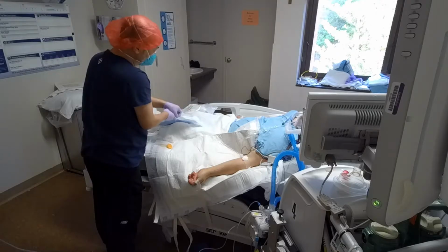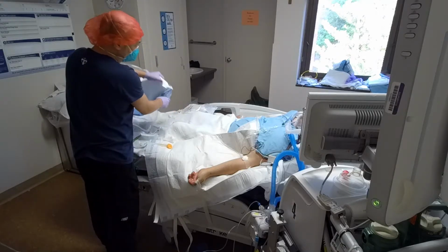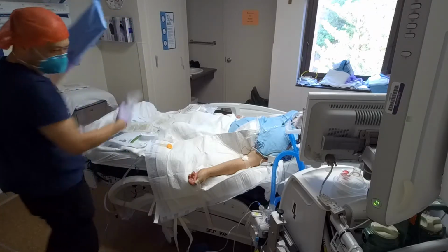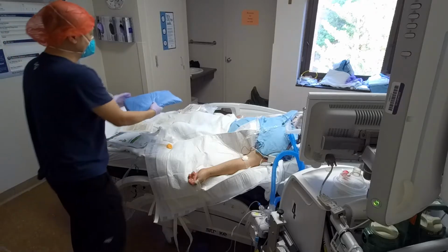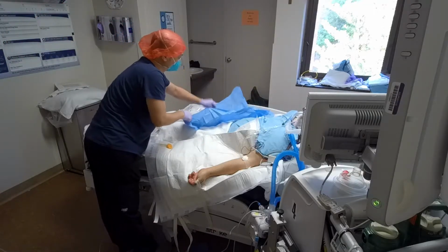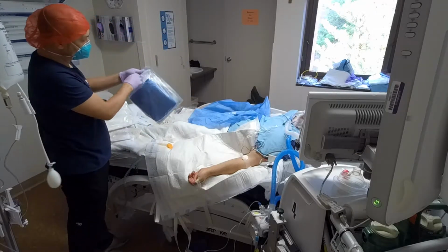Alright. If you're by yourself, you gotta get everything ready. You can get everything by yourself. If you have an assistant, they will get all this stuff for you as you ask. A lot of these are sterile. I'm just going to have this all opened up so I can keep it sterile.